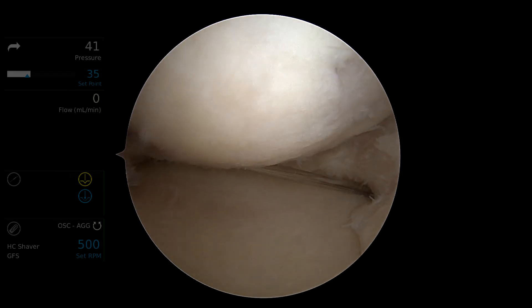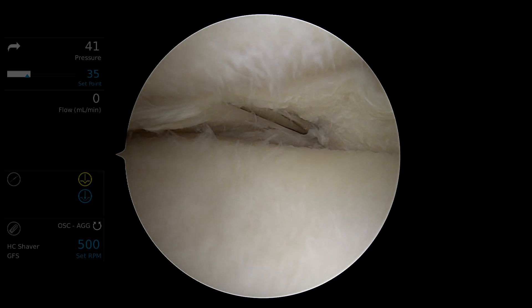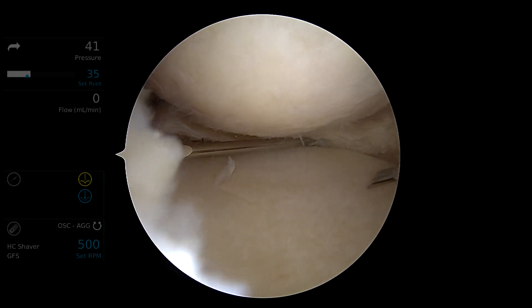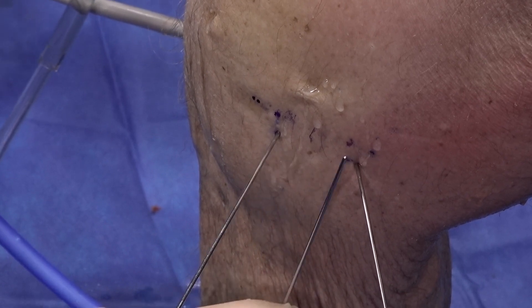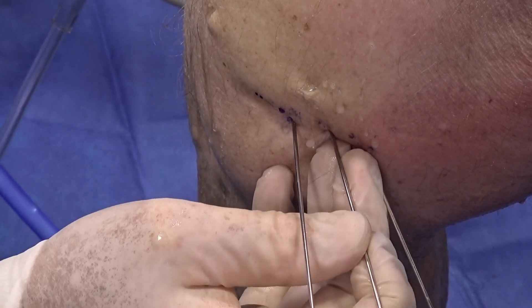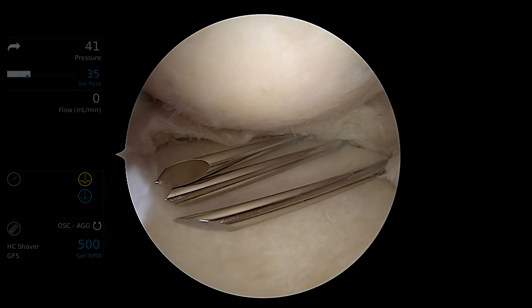With the anterior extent marked, we take our second guide pin to mark the posterior extent of the lesion, coming in just at the inferior aspect of the meniscus through the meniscocapsular tissue, parallel to the articular surface of the tibial plateau, pointing the tip at the tibial spine when drilling. We typically like the anchors spaced at a distance of about 1 to 1.5 centimeters. For a lesion of this extent requiring a third anchor, we bifurcate the distance between the anterior and posterior extents, again parallel to the articular surface pointing at the medial aspect of the tibial spine.